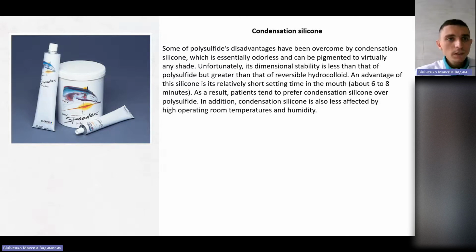But if we talk about condensation silicone, there is a wide use of this silicone in Ukraine. So we use Speedex, another species of these condensation silicones. So it is very popular in our country.